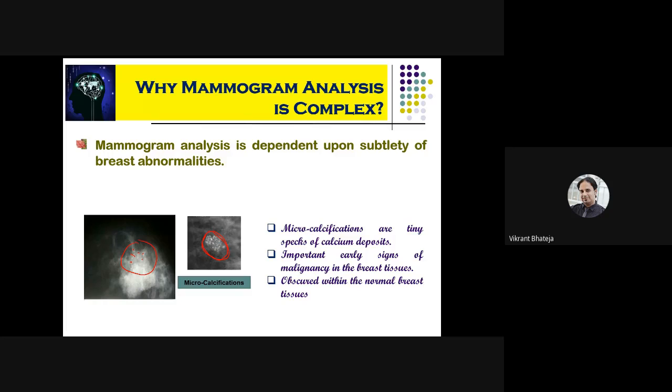So now with this, you can try to correlate and ascertain that if some image processing is being applied over here, or the kind of image processing algorithm applied for visualization of these types of anomalies, certainly it cannot be just a simple or conventional image processing algorithm that could be directly applied. You definitely need some specialized touch in the algorithms, which customizes that particular algorithm so that it can highlight or visualize these types of abnormalities.